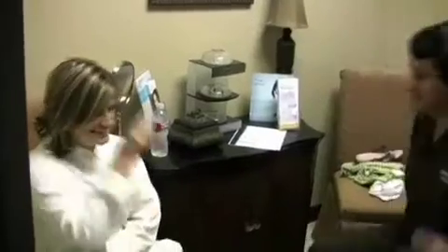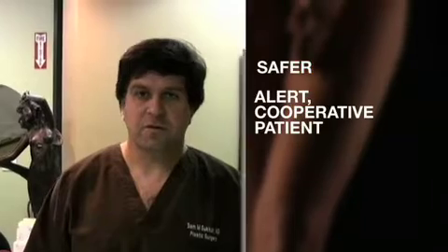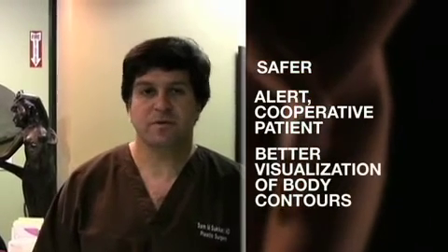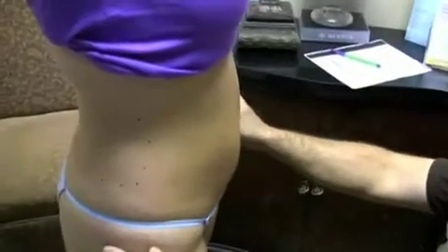What's the advantage of doing it that way? There's a multitude of advantages. Potentially it is a safer procedure because there's no general anesthesia. In addition, the patient can cooperate with us, so it makes the visualization of the procedure much better, in my opinion, because we can appreciate the contours of the body as they really are. So now we're going to mark her. Let me have you turn.